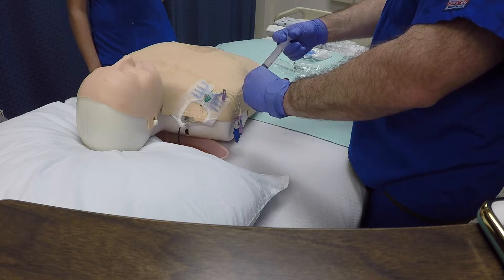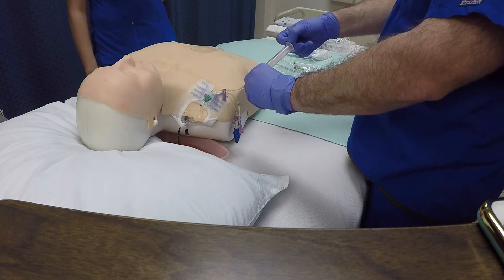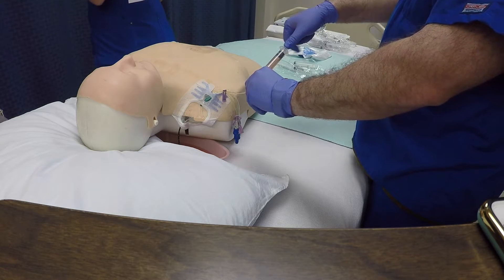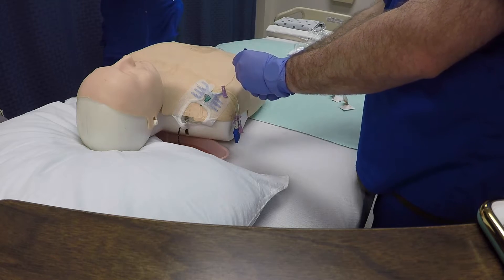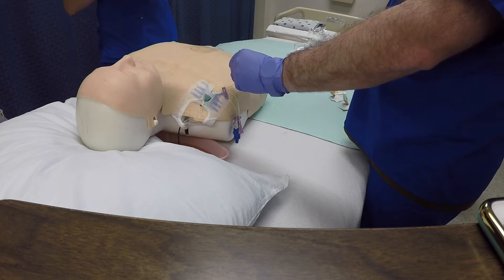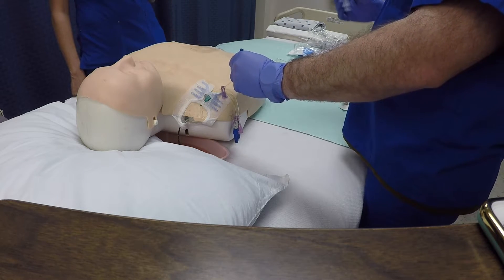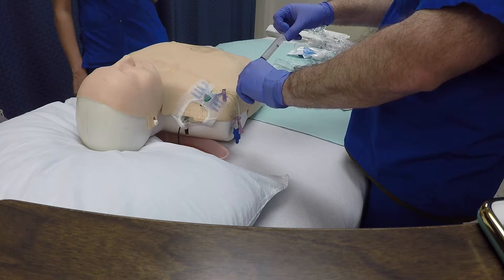The second key point is to waste ten cc's of blood with the same syringe, and that's to obtain a clean specimen. Step number four is to collect the specimen. Key point number one is to draw ten cc's of blood, and the reason for that is because it's the recommended amount.